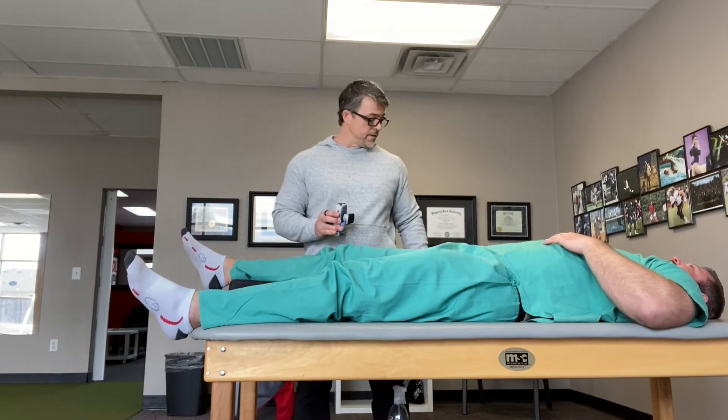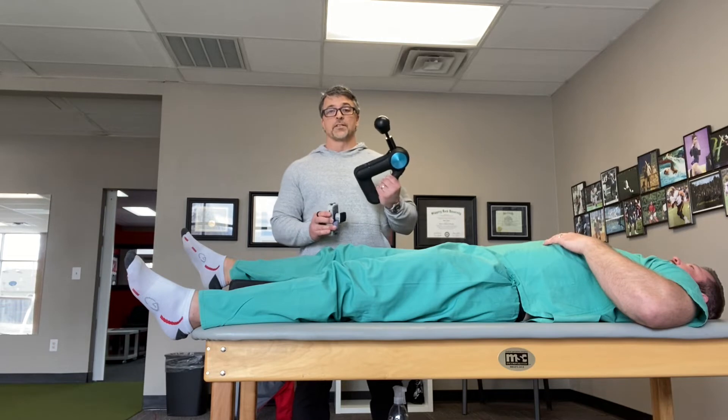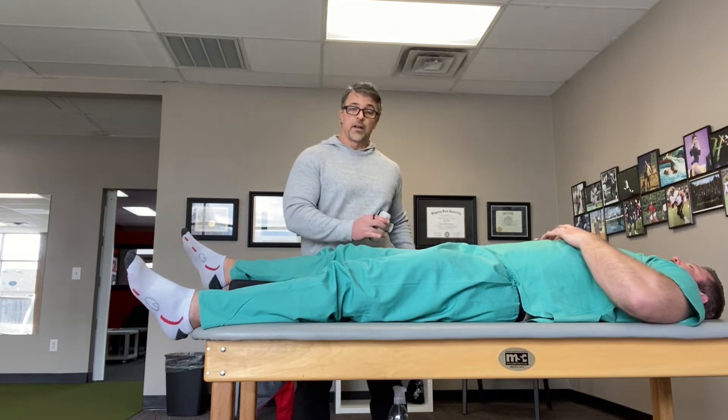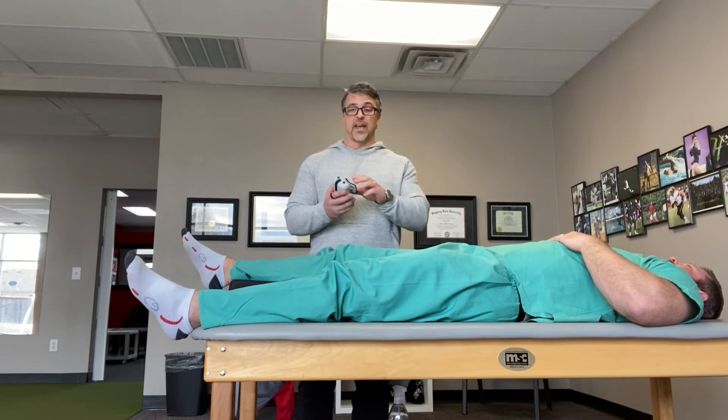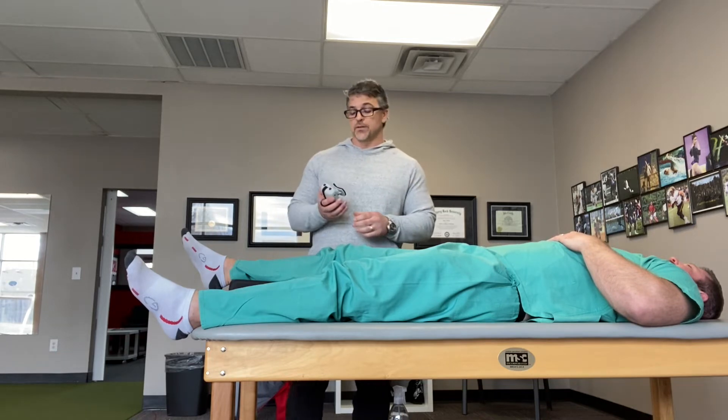Physiological effects of the Theragun, or percussive vibrating gun, on quadriceps facilitation. We're going to measure the effects with a handheld dynamometer in foot-pounds of force.